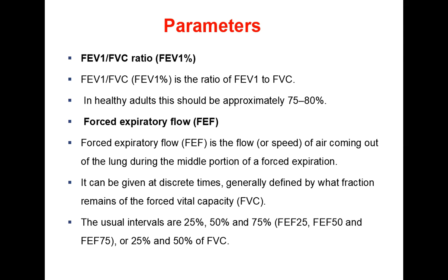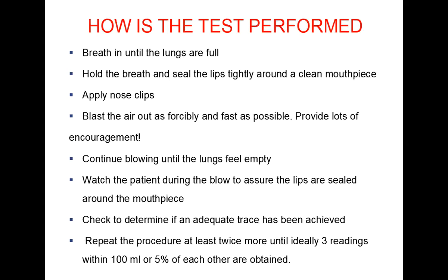Breathe in until the lungs are full, hold the breath, and seal the lips tightly around a clean mouthpiece, and apply the nose clip so as not to breathe from the nose. Blast the air out as forcefully and as fast as possible. Provide words of encouragement.